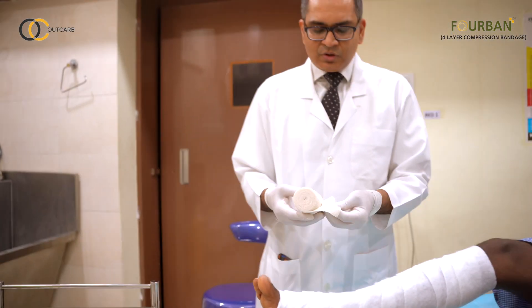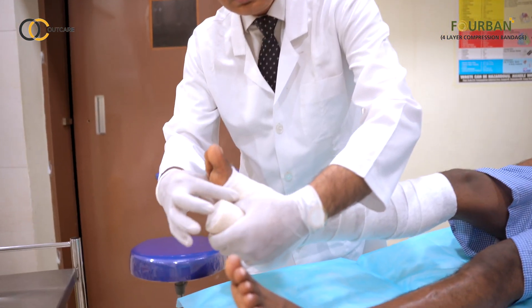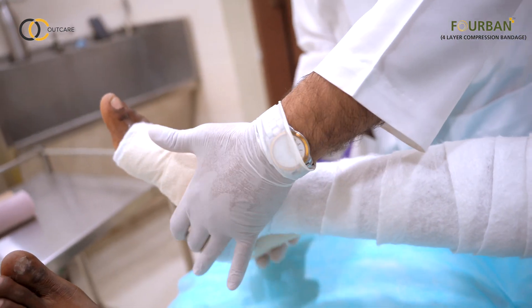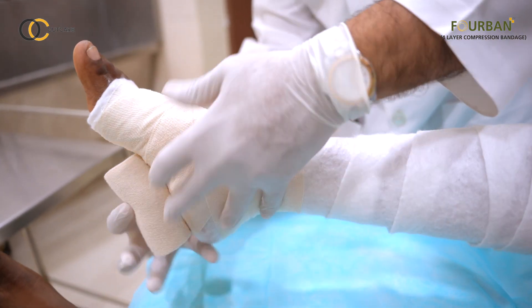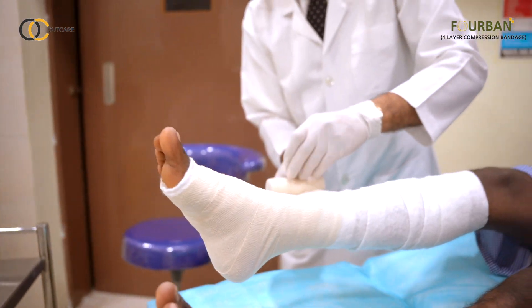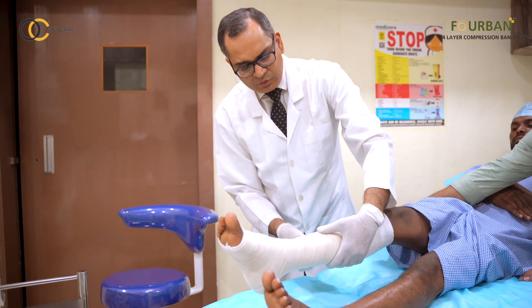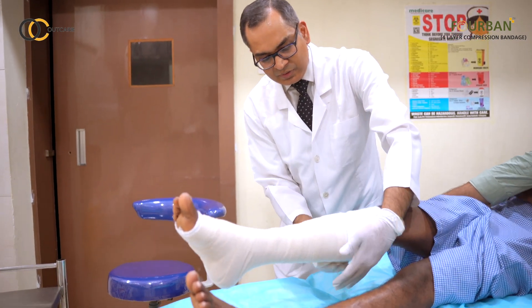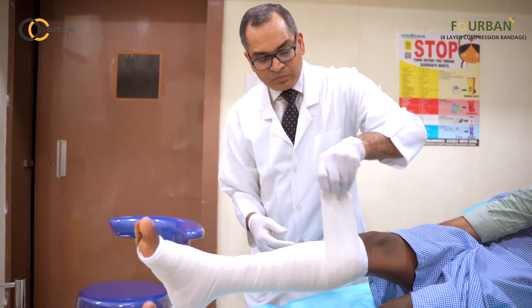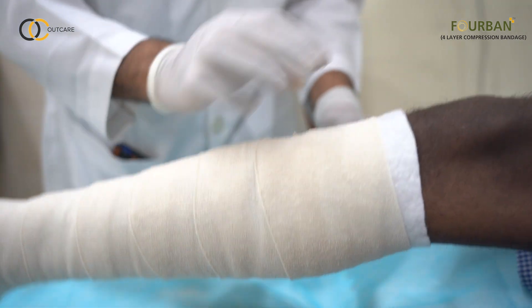Then we come to the second layer, which is the conforming layer — the light compression bandage. We start again at the base of the toes, first going in a spiral fashion up to the ankle. At the level of the ankle, do a figure of 8, go once again on top in a spiral fashion with 50% overlap, up to 2 cm below the popliteal crease.